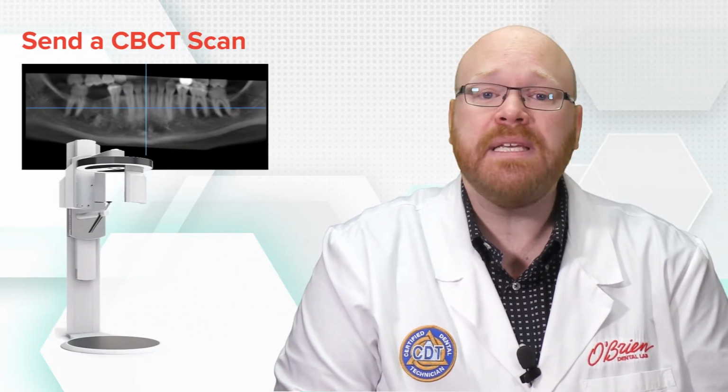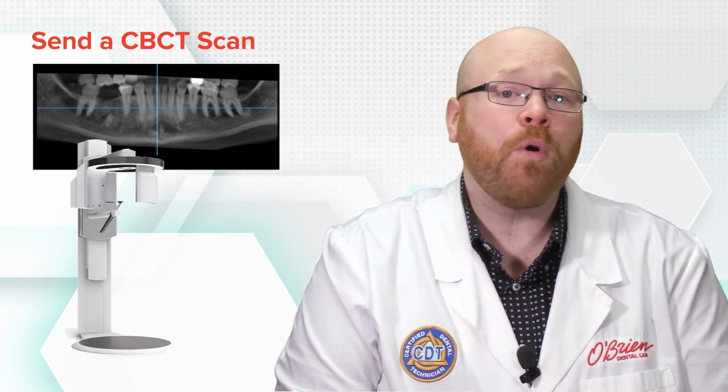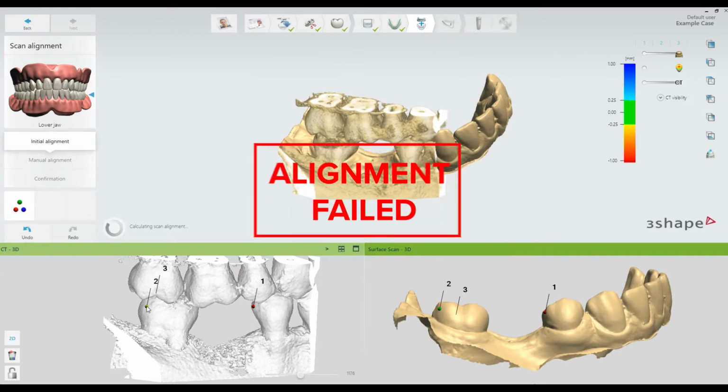Next, we'll need a CBCT scan of the patient. This can either be a full head scan or one with a reduced field of view. Keep in mind though that if the field of view is too small, it may create problems when trying to match up the model to the CT scan.